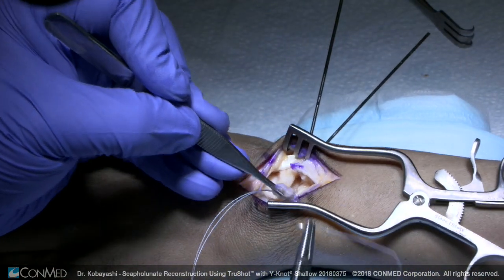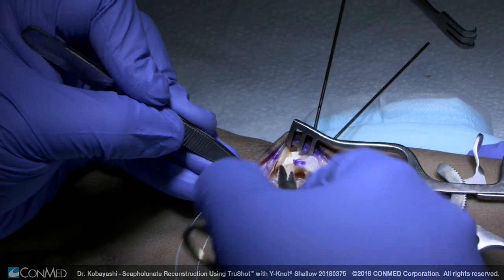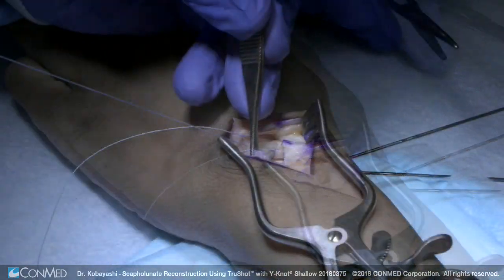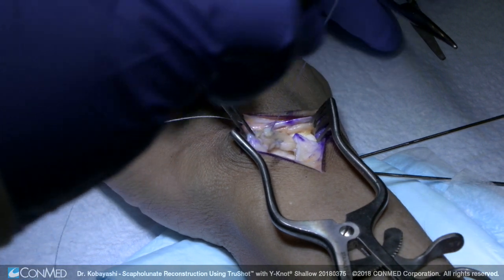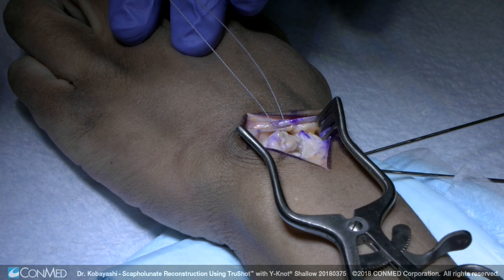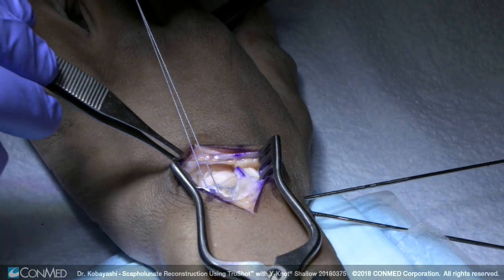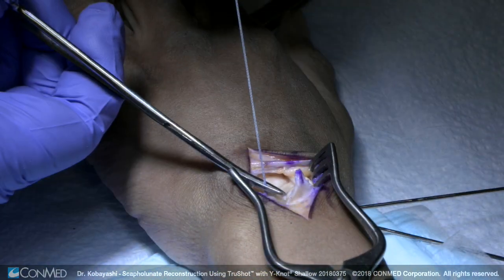Make sure there's good tension across there and we'll bring a locking suture right there. Come back down on the other side — plenty of good bites in here. That's kind of locked in there now. We'll sew the ligament just right into there. I'll put one more so that it exits perfectly through the dorsal aspect here, getting a good locking interface of the sutures. Once you get your ligament anchored into the lunate, I like to pass this through the dorsal radiocarpal ligament — it acts as another constraint to scaphoid flexion — and then we'll tie this down as well. Go ahead and cut that.